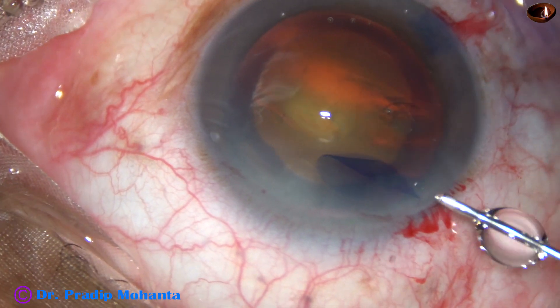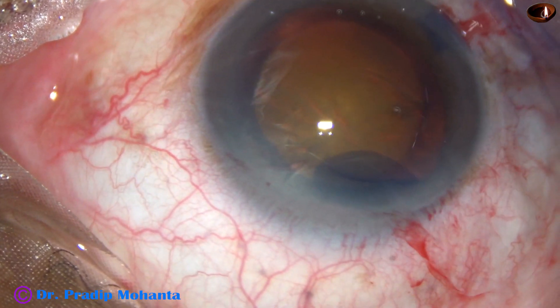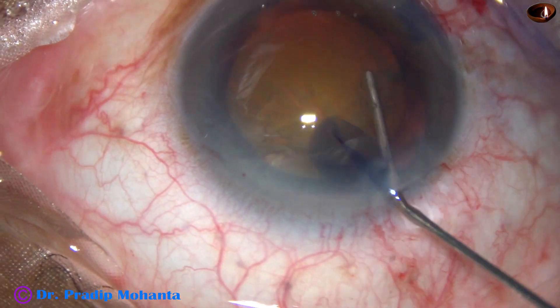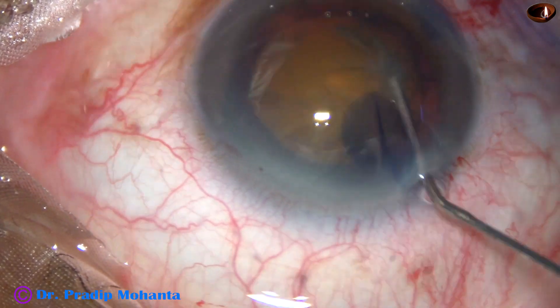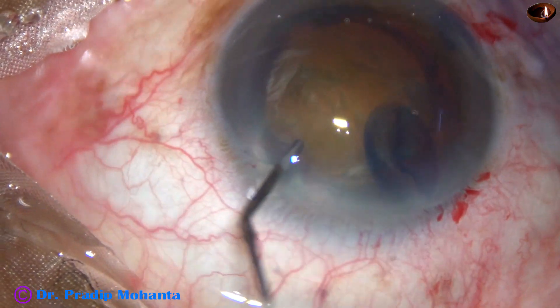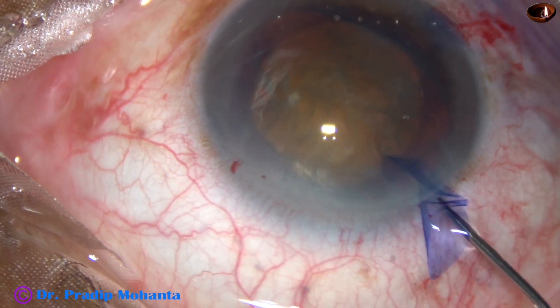Hydrodissection is done with a 27-gauge cannula. The fluid wave goes from one side to the other side. The nucleus is then rotated and the capsule is freed.